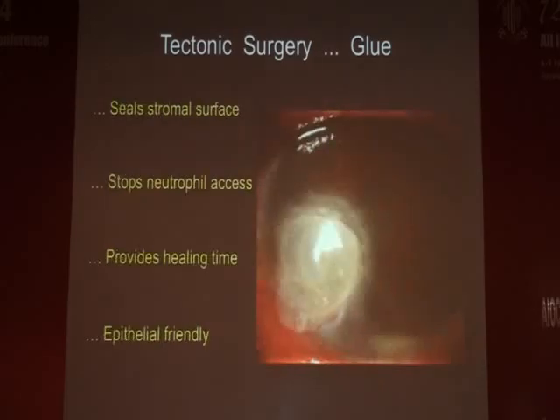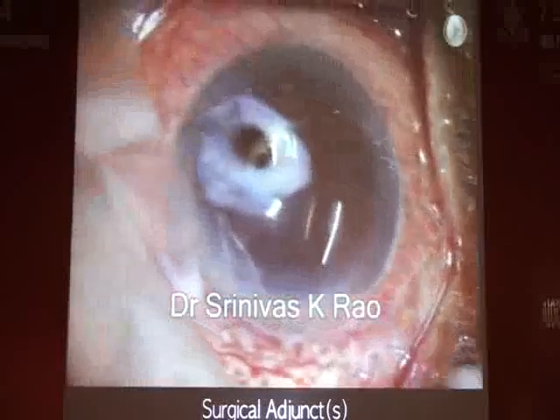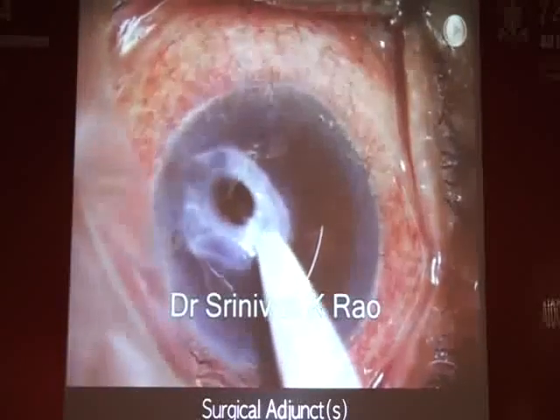we can use cyanoacrylate glue to help because this seals the stromal surface. It stops neutrophils from accessing the melting stroma and buys us time for both stromal healing and epithelialization. The technique of cyanoacrylate glue is quite simple. You don't need to be a corneal surgeon to do it. This is an eye with a rheumatoid corneal melt and a descemetocele seal.